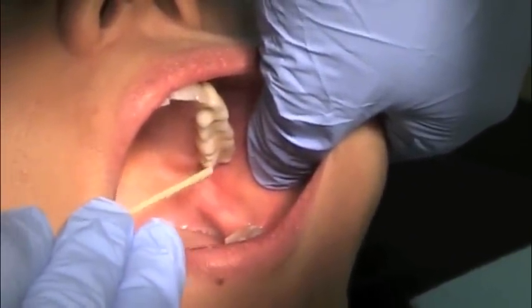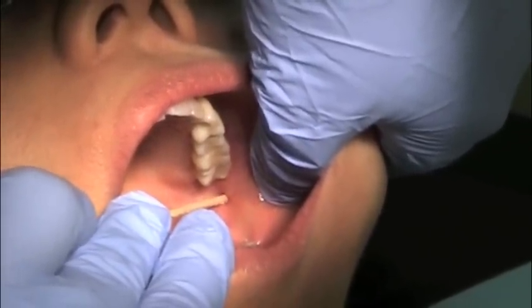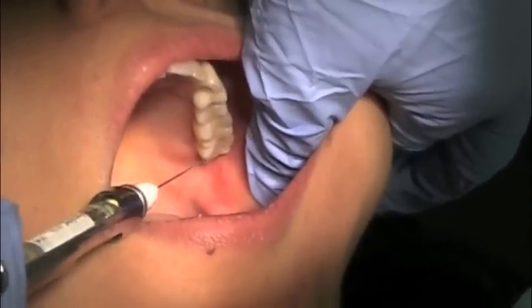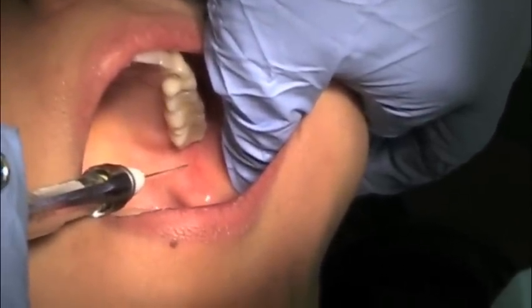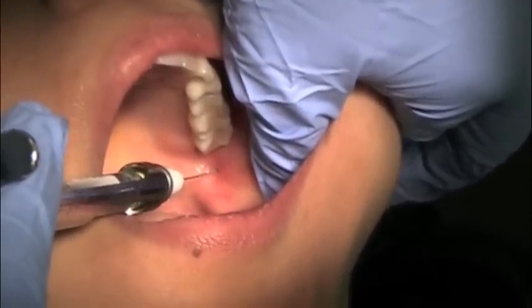Identify the mesiolingual cusp and distal buccal cusp on the maxillary second molar. The insertion site is at the height of the maxillary molar. Place the syringe at the opposite corner of the mouth. Target towards the index finger. Insertion is at the height of the maxillary second molar.